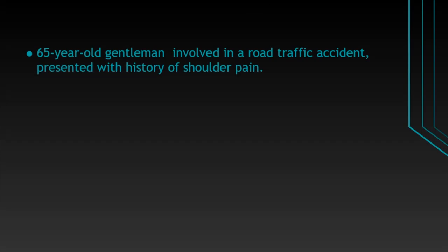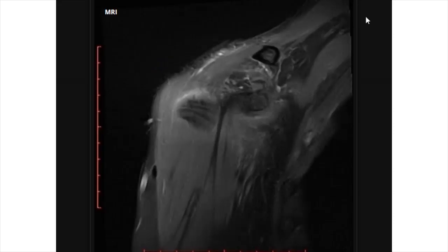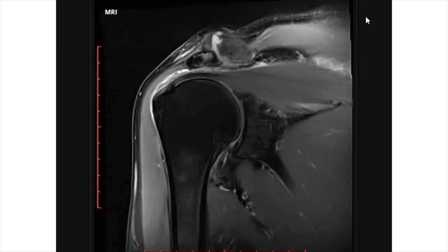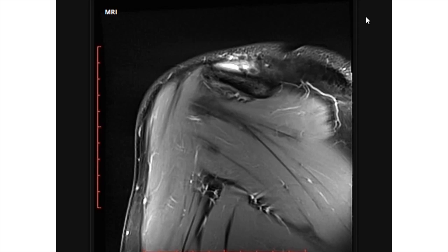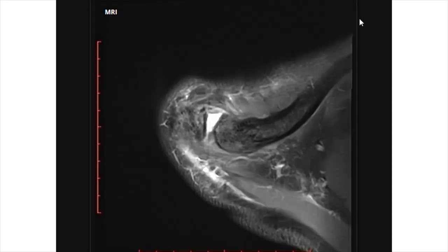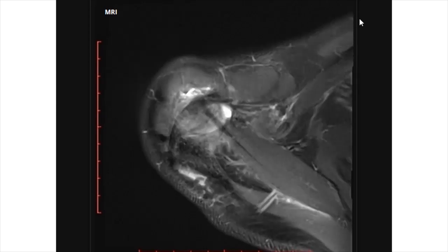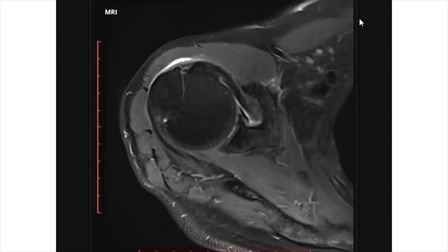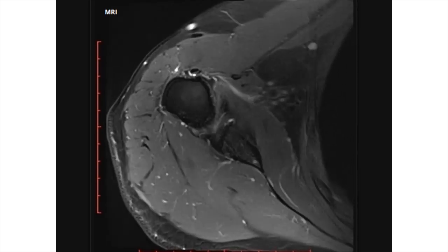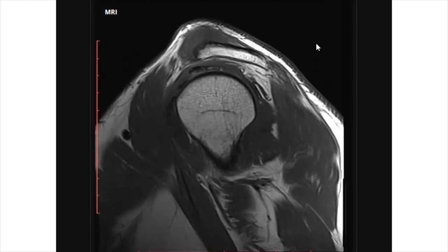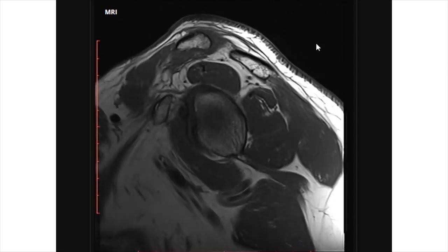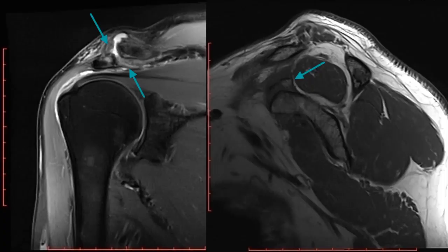A 65-year-old gentleman involved in a road traffic accident presented with a history of pain, and an MRI of the shoulder joint was performed. The coronal PD fat sat image shows acromioclavicular joint dislocation with complete tear of superior and inferior acromioclavicular ligaments and superior displacement of the clavicle relative to the acromion.